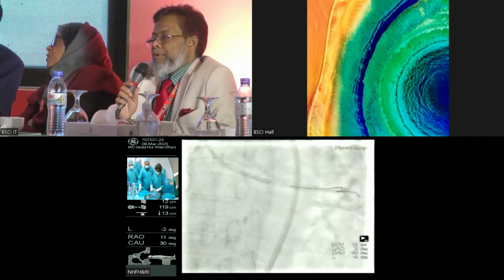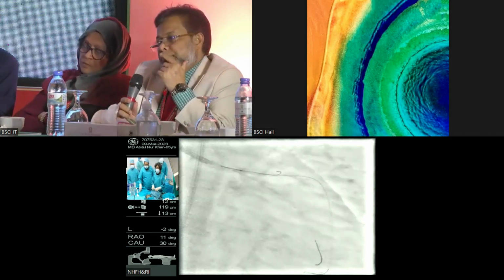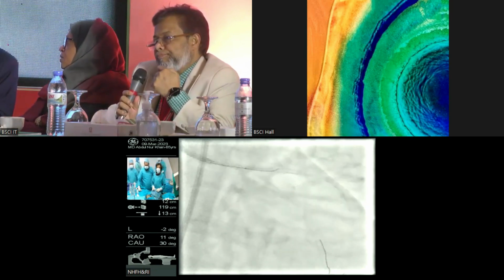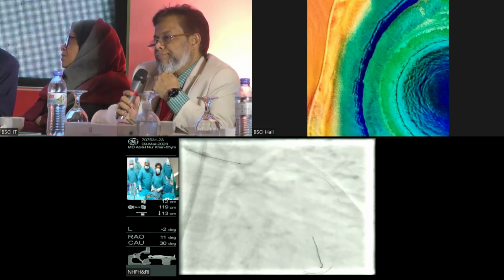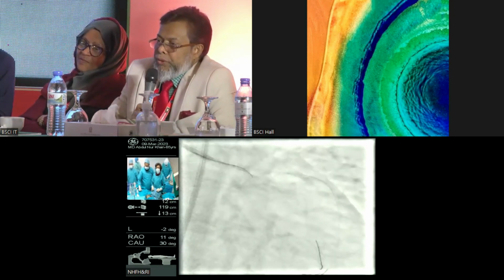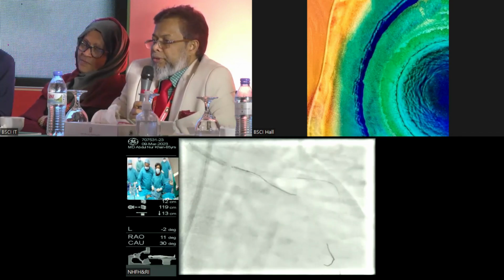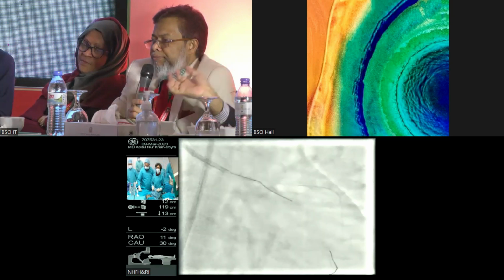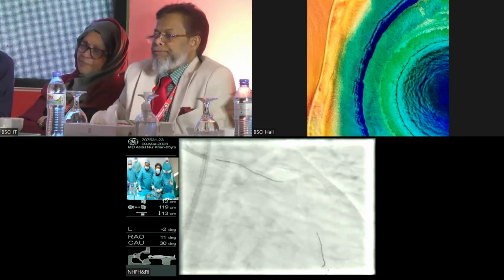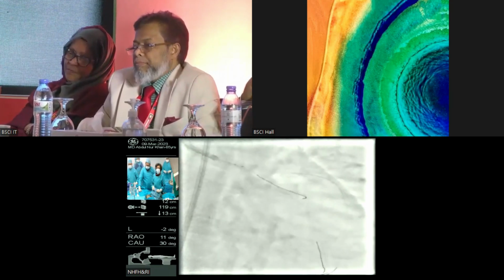One thing that you must have noticed, for those who are starting, is that we did a post dilatation with a 4 millimeter balloon. So even though we have a jailed wire, we have opened the struts of our stent in the proximal part to the best of our ability. Now we are crossing into the LCX through the microcatheter. Yes, we have a Fine Cross microcatheter, and that has helped guide us. We want to just follow this because this is a small branch.